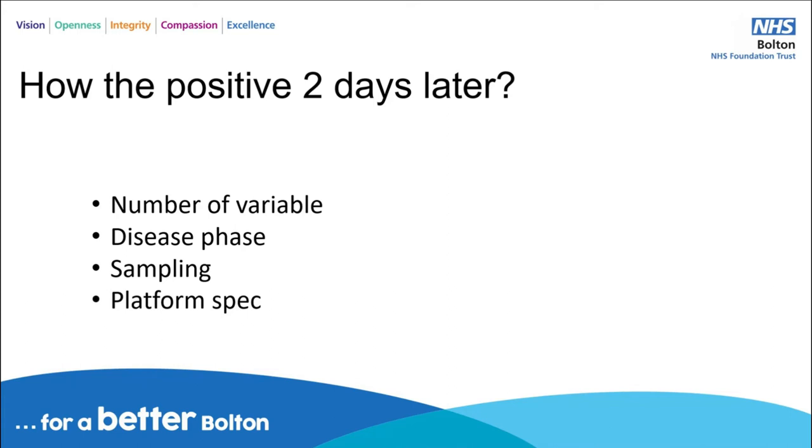Are we able to mimic real life issues that are going to occur post sampling? So that's low antigen presence in the sample, control material, third party control that's going to test the limits of sensitivity and specificity of the test. And so it's really important that first party controls, like I said, are either really high positives or really low negatives, and trying to find control material that's able to cover a wide aspect of testing is really important. So it should mimic these. This is what UKAS are saying, that you should be acquiring or implementing control material that is able to mimic real life situations.